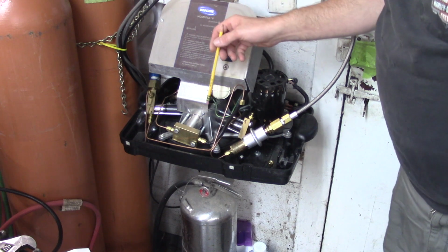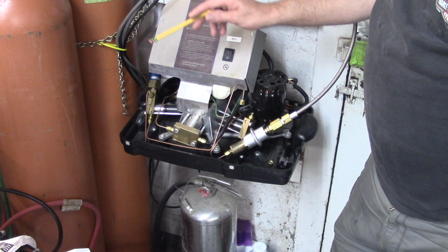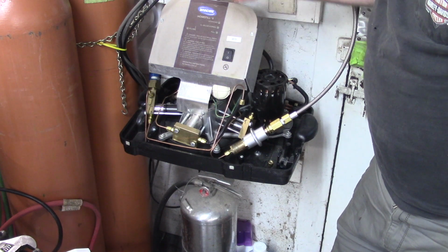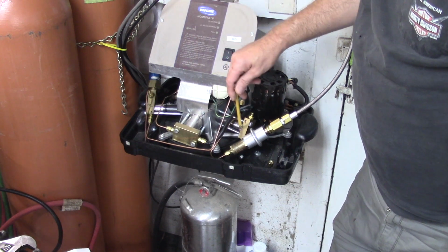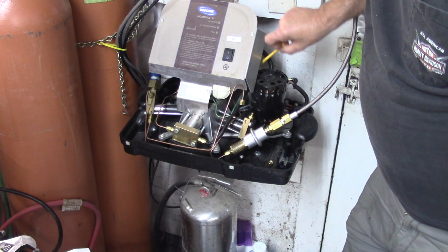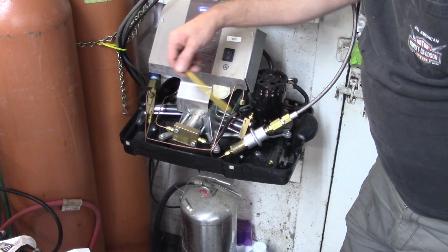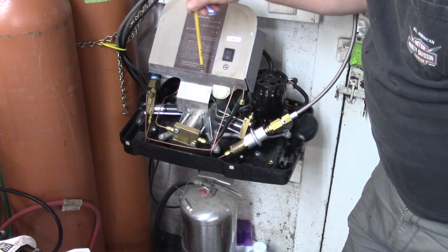If I had a spare one of these, I would have taken the whole thing apart to see exactly what was inside of it. Measured all the cylinder bores, and because that's just the way I am, marked the outside of the cylinders with bore sizes, which is what I should have done here, but I didn't. So you have cylinder 1 in the back, cylinder 2, and then cylinder 3. If you follow the lines, it's pretty self-explanatory. If you can follow a basic flow chart, you can tell exactly what's going on.